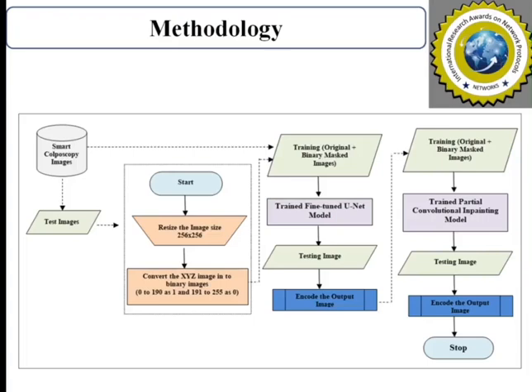Then they are converted to XYZ images because RGB digital images may vary across devices, but XYZ is device independent. It does not affect the quality of the images on different devices.